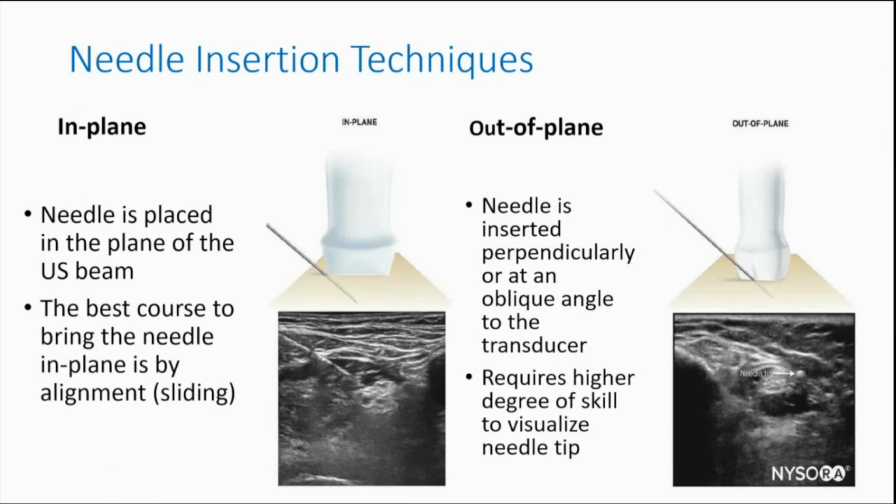Whereas if you change it to the resolution mode, especially in the superficial part of the screen, you get very good resolution, but you can't see much deep inside. That's my experience. So whenever I use the Sonosite, I will always change the mode in that sense.